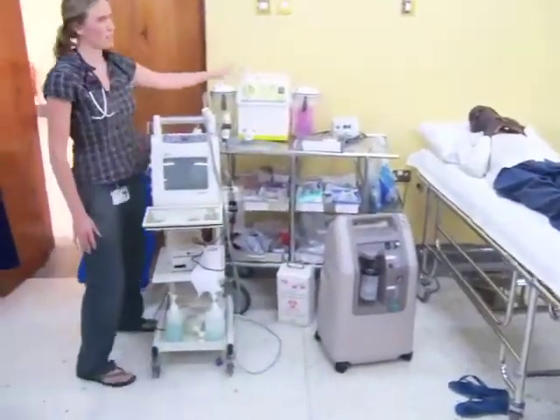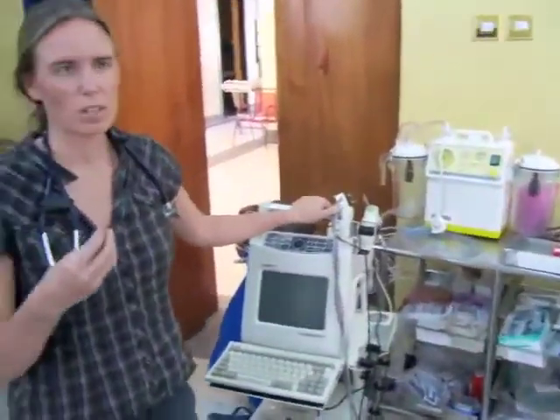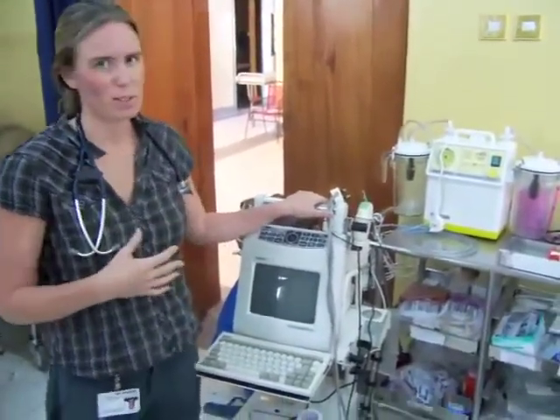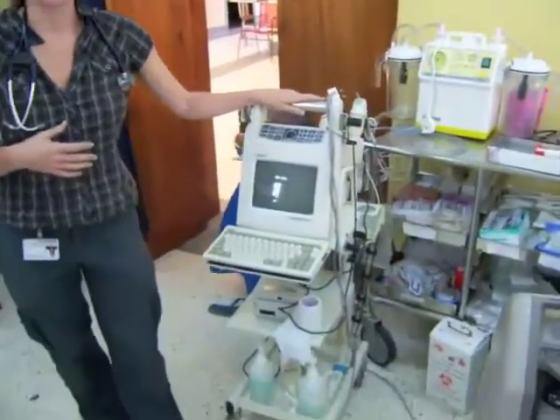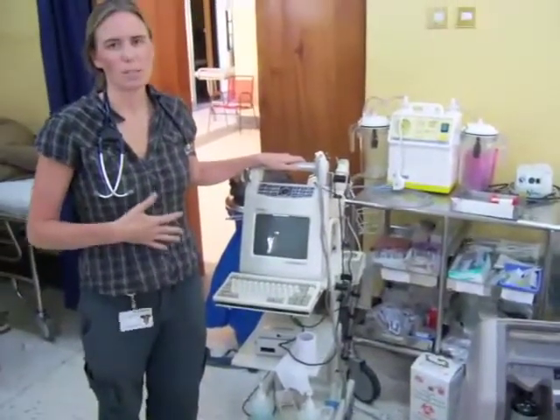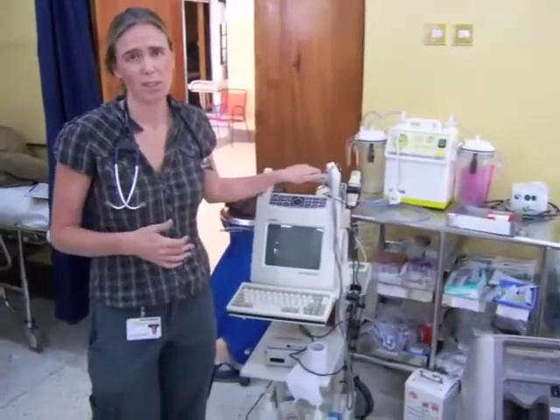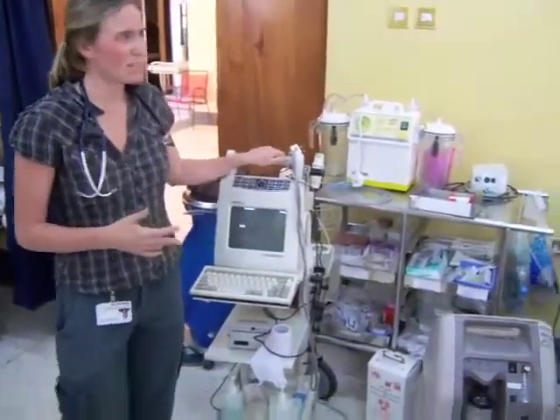The second is our suction machine, which helps us when people are having difficulty breathing because of too much fluid in their mouth or in their throat. That helps us very much as well. And this is our ultrasound, which helps us do quick bedside evaluations of people's abdomen, chest, and other concerns that we might have when we can't get a hold of our radiographer or when there is not time to move the patient somewhere else. So again, these are 3 big pieces that help us take care of our patients here every day. And so that is our quick tour.